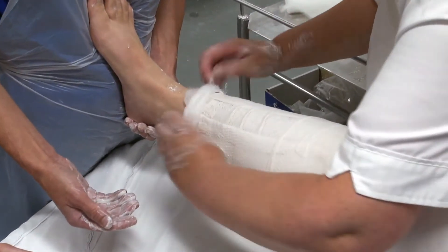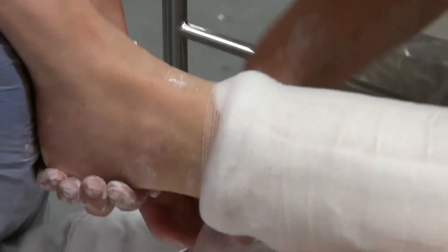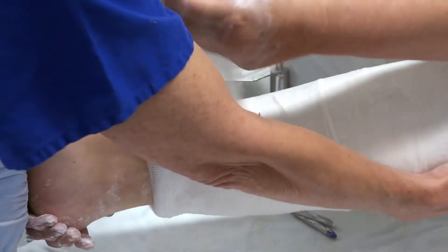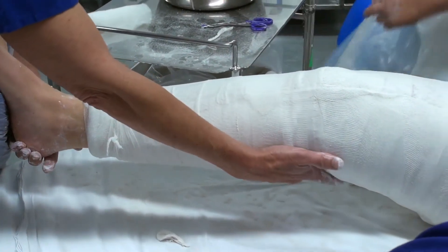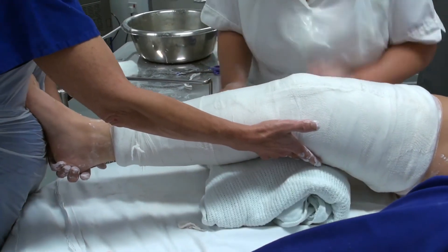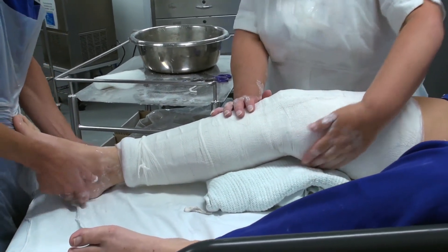I'm just trimming a little bit of plaster off at the end there just so it doesn't rub on the ankle joint. Just turn back the padding and now I'm going to secure with the bandage. Now we need to put a pillow or blanket just underneath the knee there to give some support and allow the plaster to harden off. So that is a cylinder back slab for you.